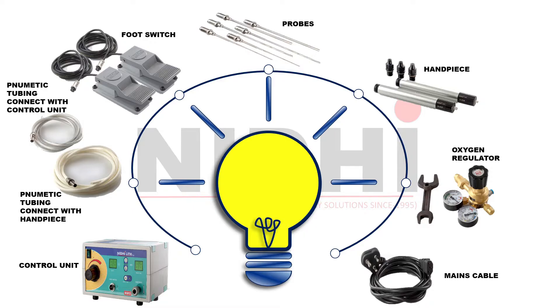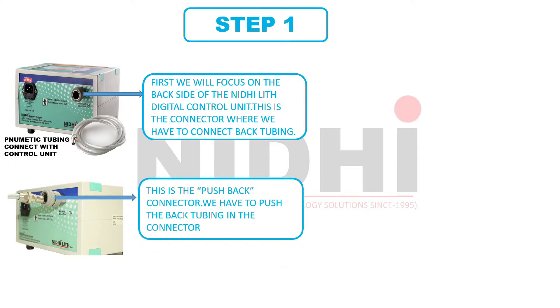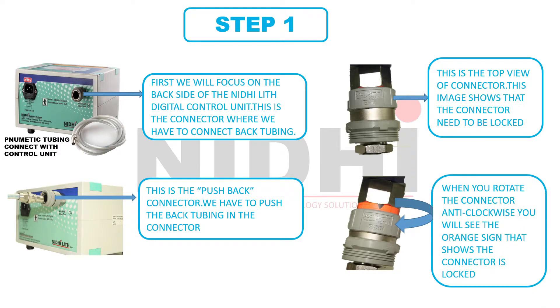Let's start step one. We will focus on the back side of the NeedyLit Digital Control Unit. This is the connector where we have to connect the back tubing. Here we will use the tubing which is of high diameter — the thick one compared to the other. Remember, this is the push-back connector; we have to push the back tubing into the connector. This is the top view of this connector. To lock the connector, you need to rotate it anti-clockwise. The orange sign indicates that the connector is locked. With this connection, we have completed step one.